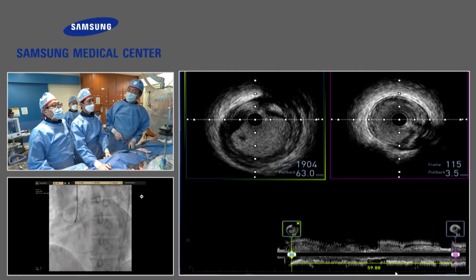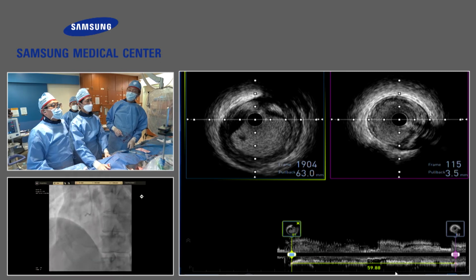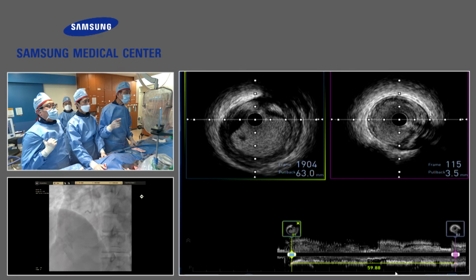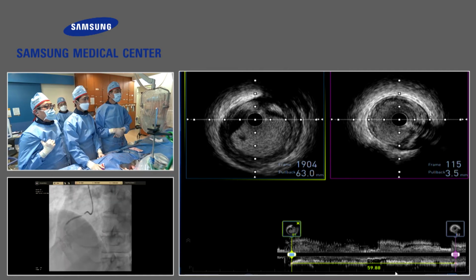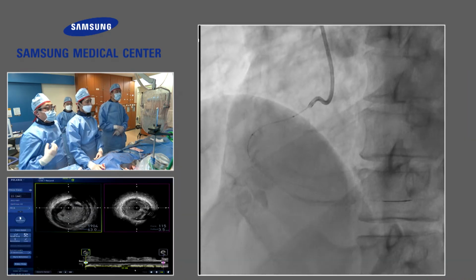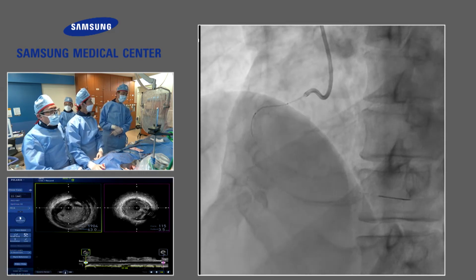The next one after 1.5, not 2.5. I try to locate the distal lesion, where does it extend to? Collateral, maybe beneath the, yeah, to the angle. Yes, marginal for the 48. So maybe we can start with the 3.0 by 48 Synergy stent, then post-dilate.